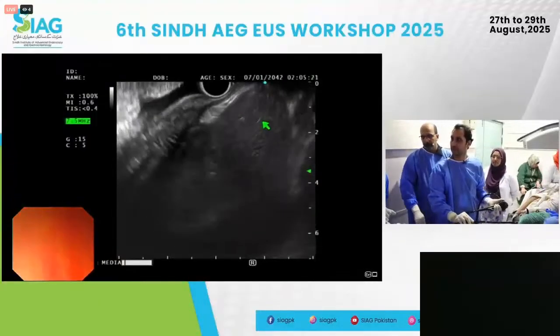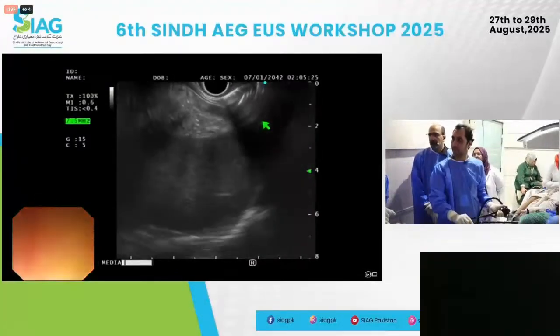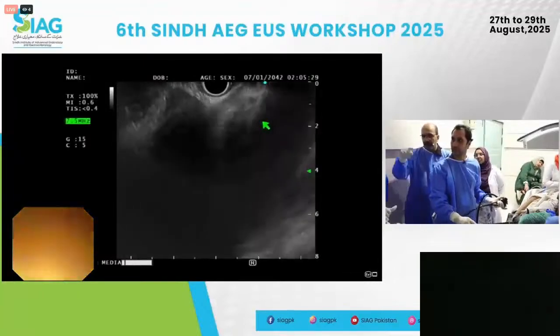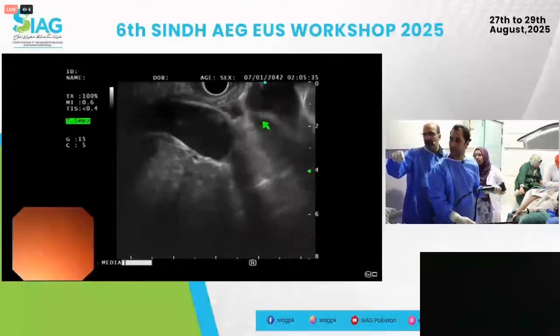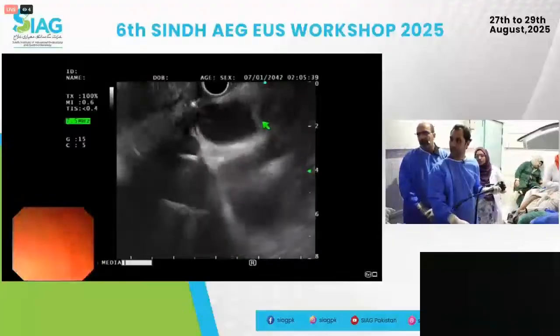Keep pulling. In the mediastinum, you do have to decrease your zoom or depth because the structures are bigger, the heart obviously is a bigger structure. So that's trachea wherever you have it, or aorta. Good. Pull back. Pull back. That's IVC going into the heart. Keep pulling back. Now you have to spin clockwise a bit.